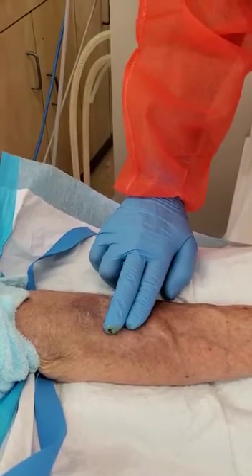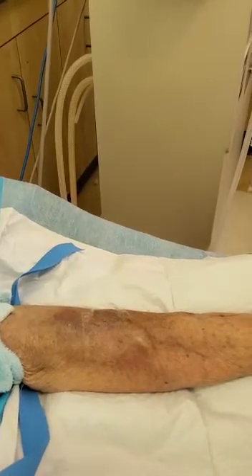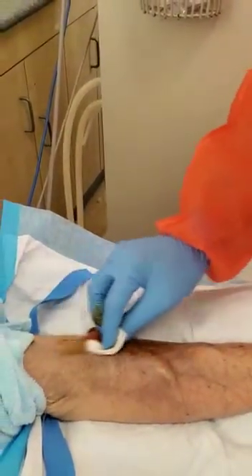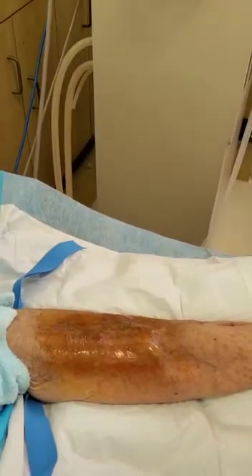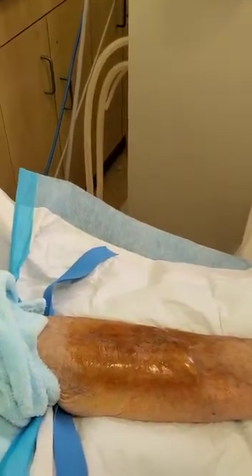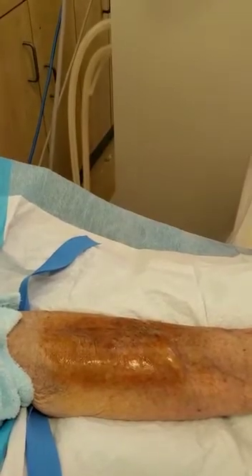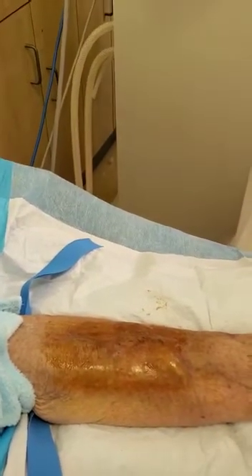He's feeling for the thrill — notice two fingers. Now he is going to clean the access site using a betadine swab. He's going to clean the two sites individually, each site separately. He's using betadine because she is allergic to chlorhexidine and alcohol, so he soaked two betadine pads to clean one side and then the other.